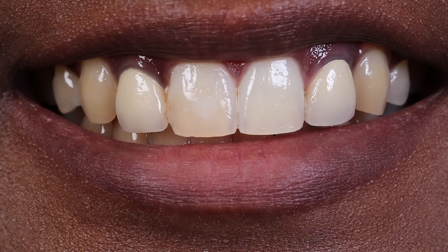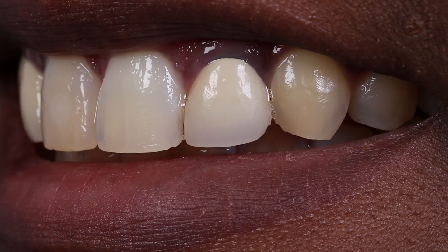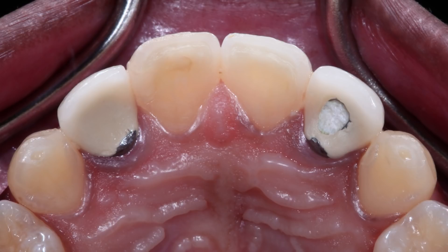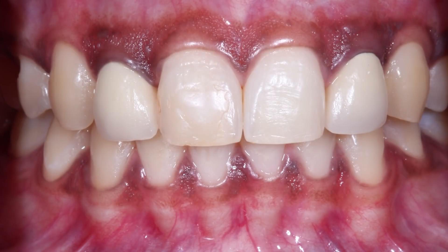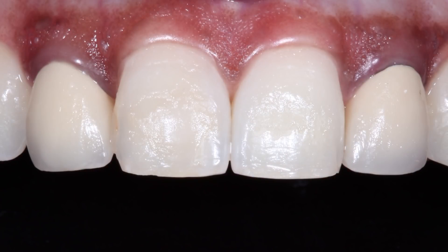For this case we have a 26-year-old female with existing porcelain fused to metal restorations on the laterals, numbers 7 and 10, which were placed to restore the teeth after endodontic treatment. As you can see from the occlusal view through the access on the lingual, number 10 has recently been retreated. The patient's goal is to improve aesthetics with more natural-looking restorations. Her complaint is the visible grayness along the gum line, especially on number 10, and that the crowns look very different from her other teeth.